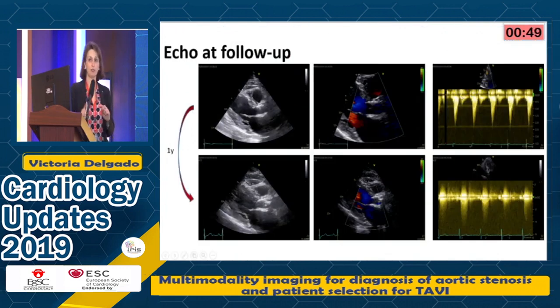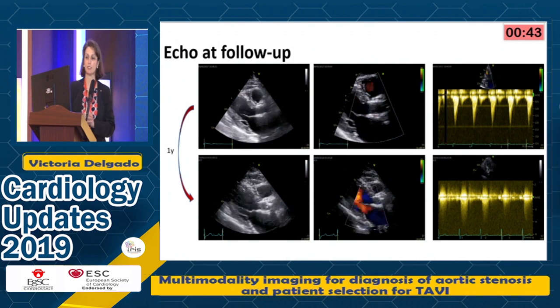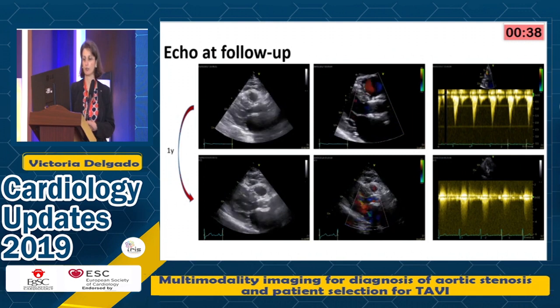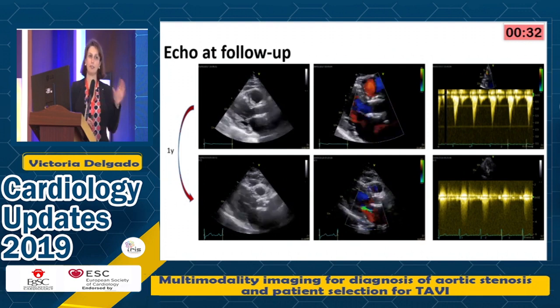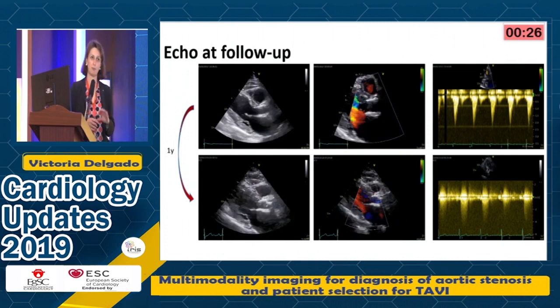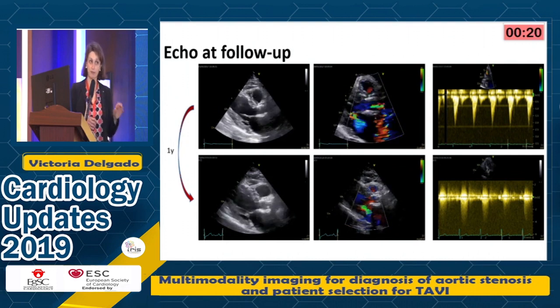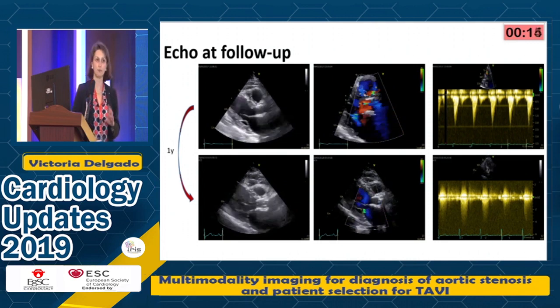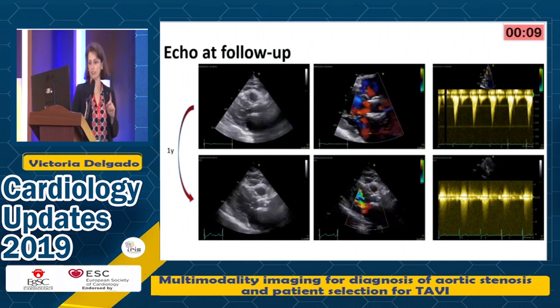It's important to see that it is not always thrombus, and I will explain this case of an 82-year-old lady who received a TAVI and had a very good result, no paravalvular leak on transthoracic echocardiography, and she developed atrial fibrillation afterwards. The patient started rivaroxaban treatment, and it had to be stopped because the patient had bleeding of the colon and a colon carcinoma was diagnosed. At that moment, the echo showed an increase of the gradient, and you can see that there is even mitral regurgitation. And despite increasing again and reintroducing anticoagulation, this didn't disappear.